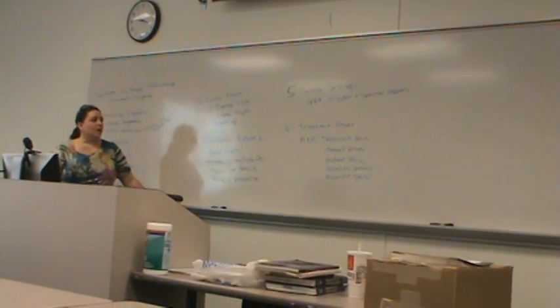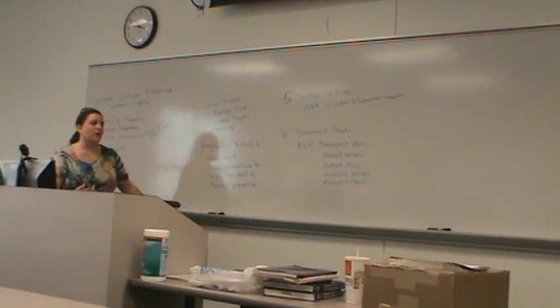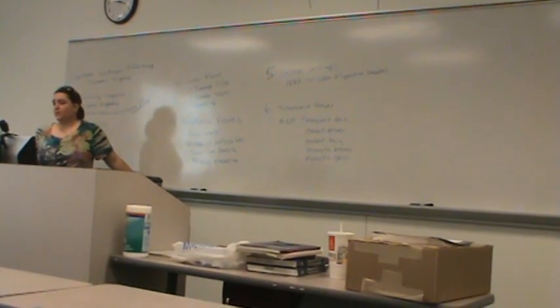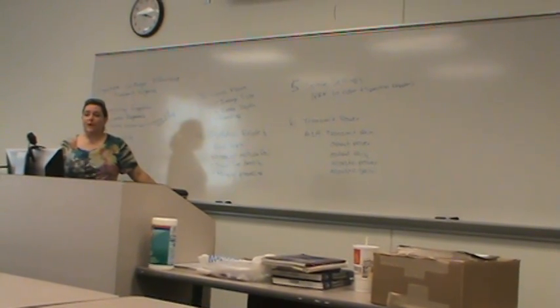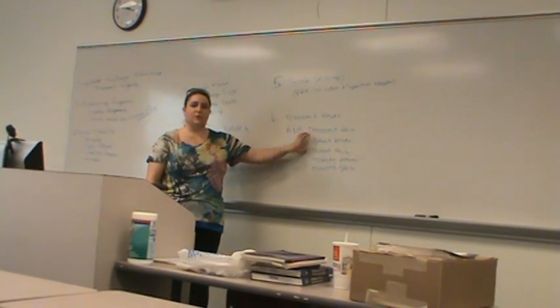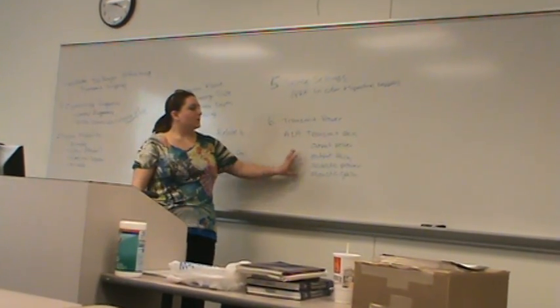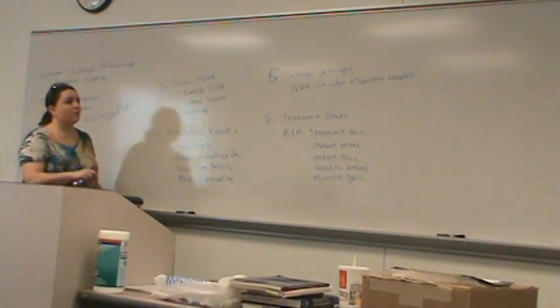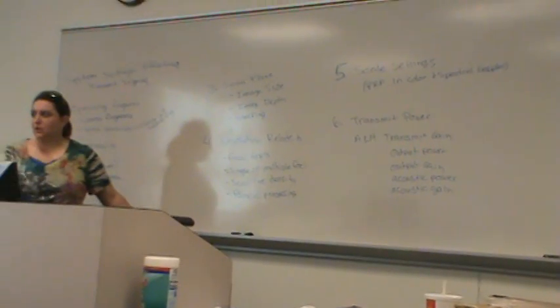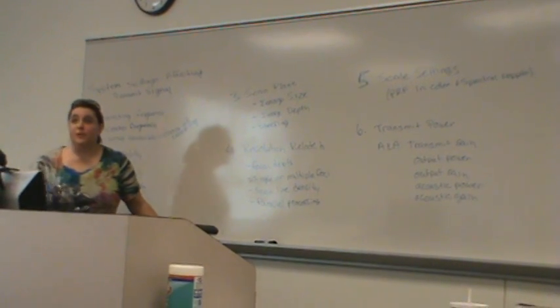So most of the time they're going to use something like transmit power or acoustic power, output power. They'll actually use the word power, but there are cases where they may use that term gain. But you have to look for this. If there's not something that says transmit or output in front of the gain, they're talking about receiver gain. So those are all the different terms. If we change that knob, that is definitely changing our test signal, the signal we're going to send into the patient's body. We're changing how much energy is actually going into the patient.